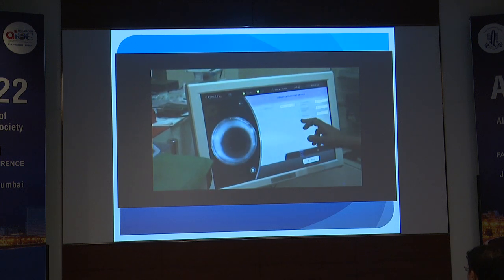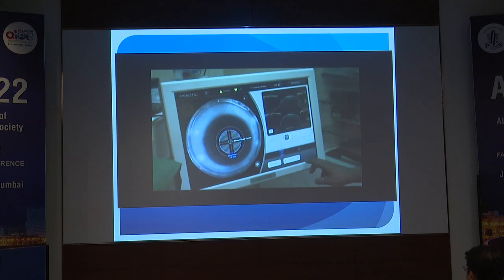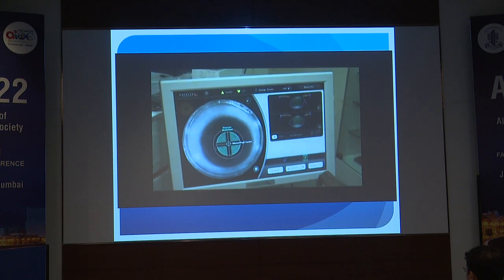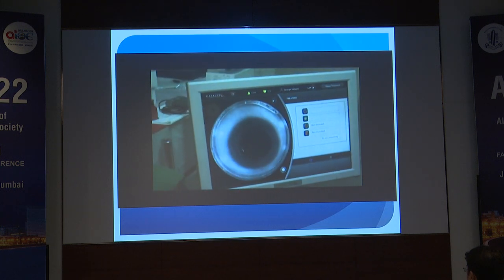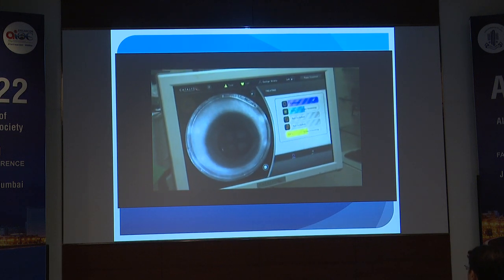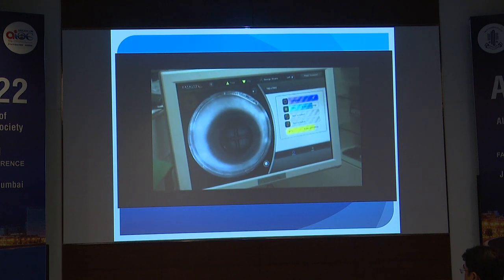I normally just do a simple cross-hatching, which works fine, well enough. The laser works very fast. There's only a few seconds, normally about 4 to 5 seconds before the rhexis is completed. One of the reasons I'm cross-hatching it rather than doing lines is purely because it is easier to aspirate these lenses out if you cross-hatch them. Though I know that most people prefer just to use 4 lines and that is it.